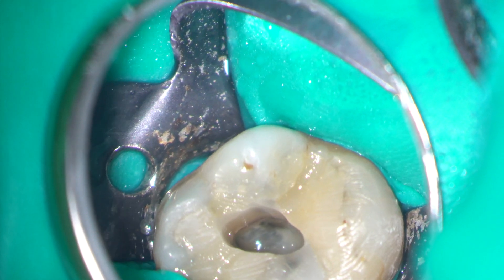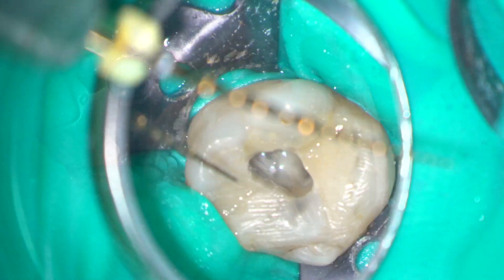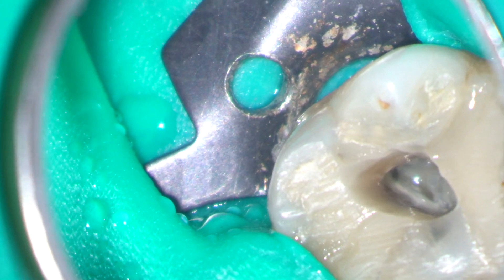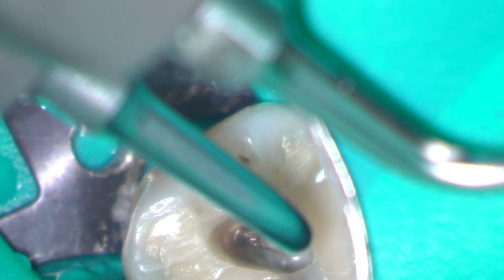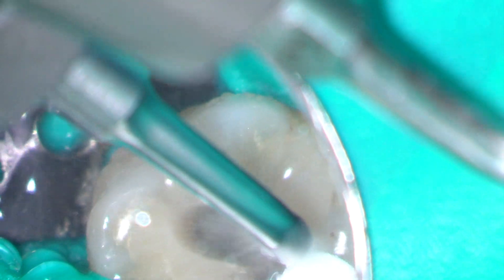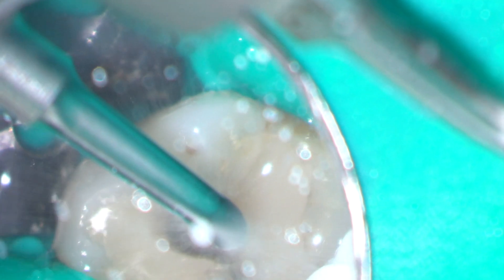In this case I used a very conservative flaring of the orifices of the root canals with a Wave 1 Gold Small instrument. Back to the hunt for the MB2 and I'm using that StarTex 3 tip again to trough a bit deeper between the MB1 and the MB2. I'm then going to pick up a micro opener to see if I can find the orifice of the MB2.